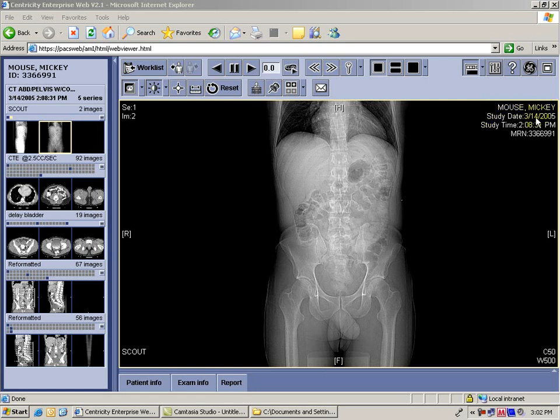I want to point out here that this study is named Mickey Mouse. This medical record number has been created for Mickey Mouse, so I'm not giving any patient identifying information here. We created this file and renamed it ahead of time.